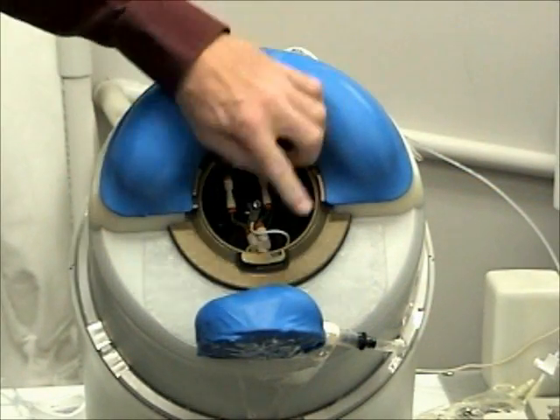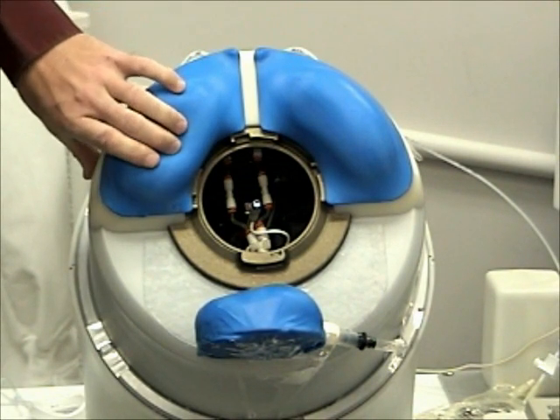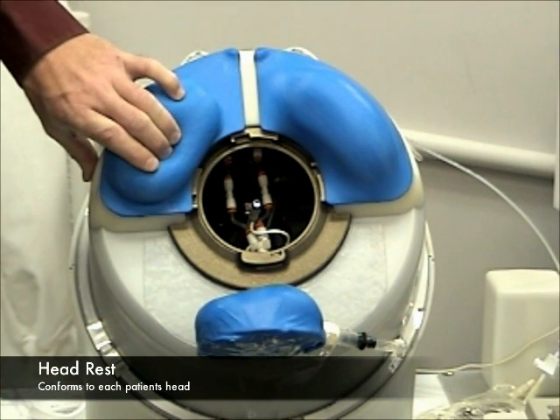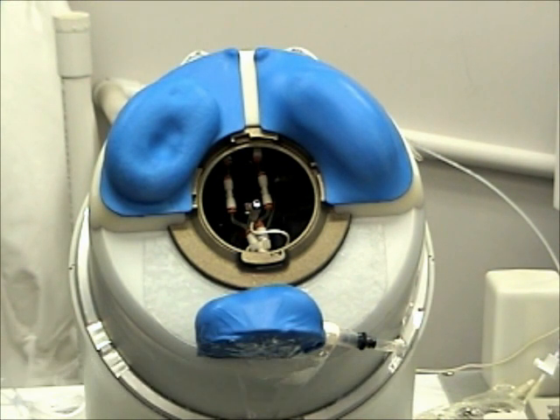The headrest is comprised of three comfortable pillows. Each pillow conforms easily to the shape and contour of the patient's face. When the patient has placed themselves in the headrest, we lock the position of each pillow to hold them firmly during the scan. When the scan is completed, we return the pillows back to their original shape.